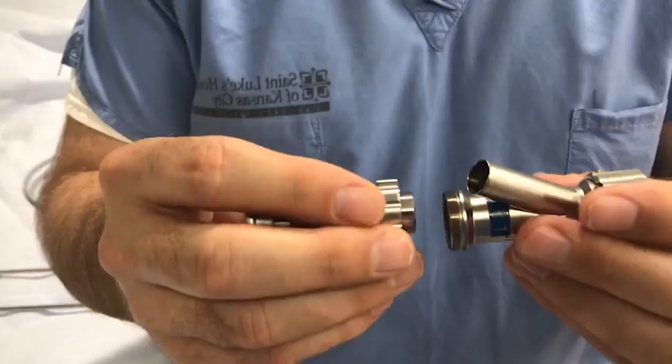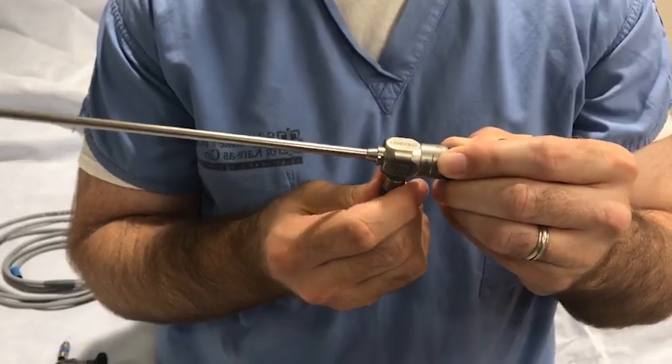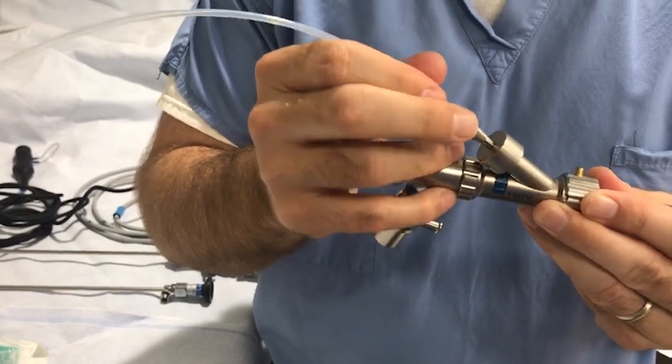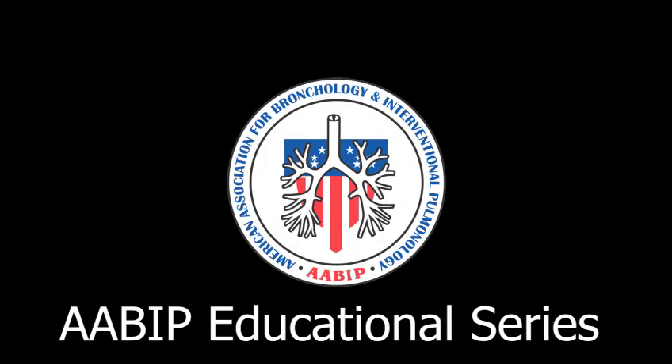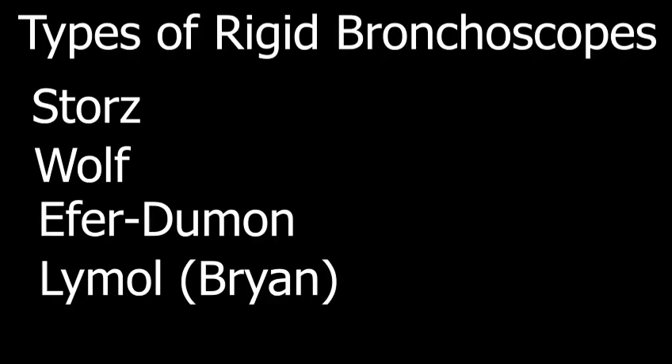Thank you for joining us. This video will demonstrate the assembly of the Rigid Bronchoscope. There are at least four different types of Rigid Bronchoscopes currently available on the market: Storz, Wolf, Efer-Dumon, and Lymol, previously known as Bryan.